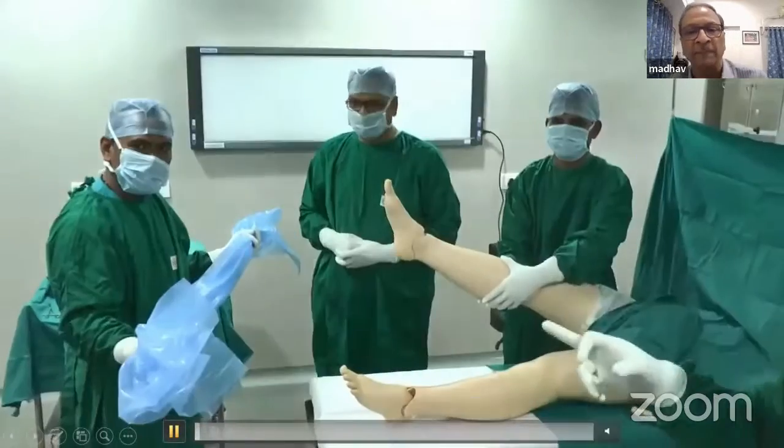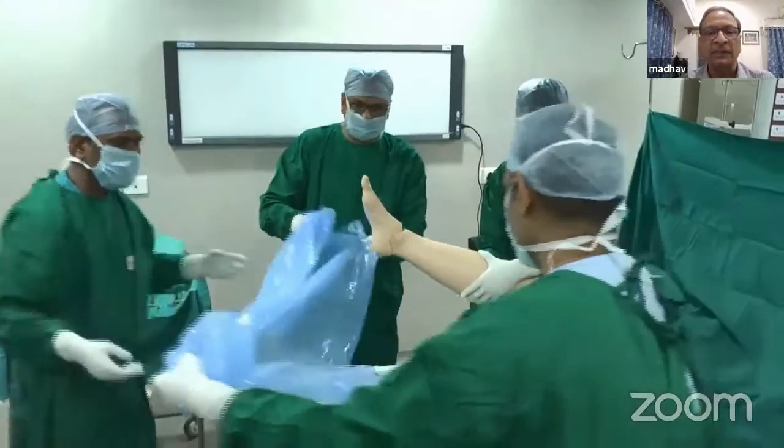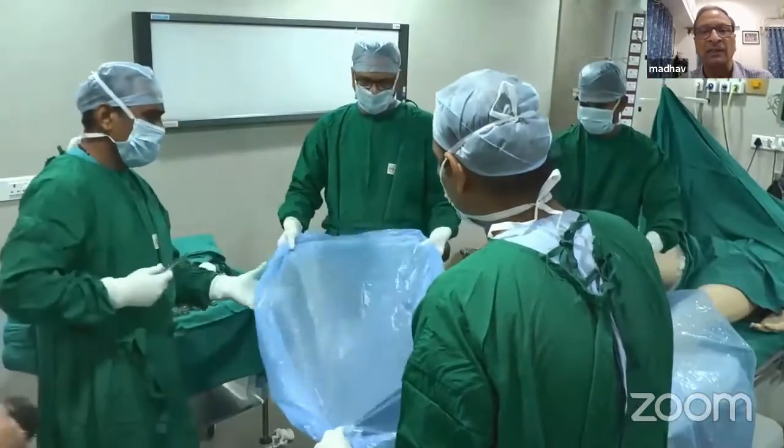So this is a trolley which has been laid. Now we will start the draping. The first thing you do is take a plastic sheet. The assistant, as you can see, is holding the leg just below the knee.